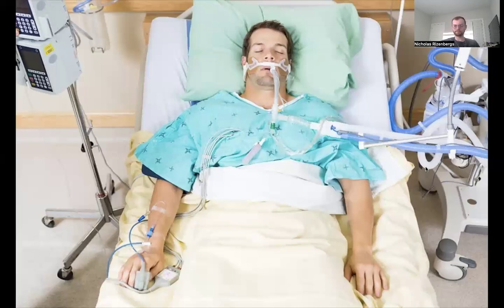I also want to, during that time where we're doing that weaning trial and watching him, be present and coach him and talk him through it. That's another big piece of it, is letting him know that, hey, this is what we're doing in this process. We're turning these rates down. You're having to breathe a little bit more on your own. We're here for you. Just try to remain calm and take big, deep breaths, efficient breaths, and not work too hard.